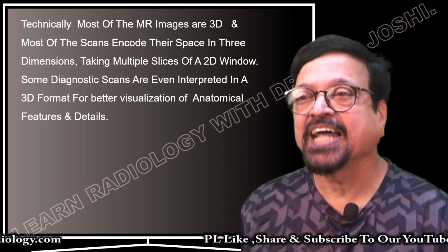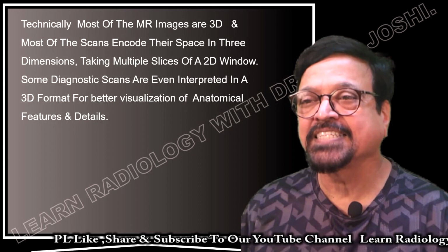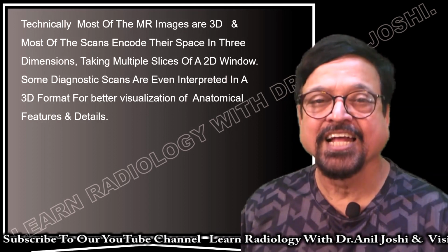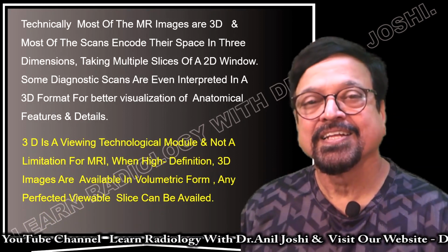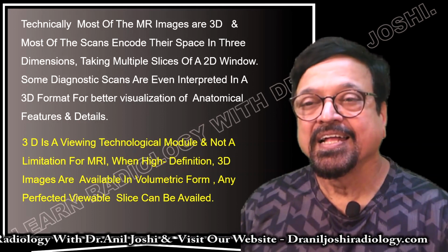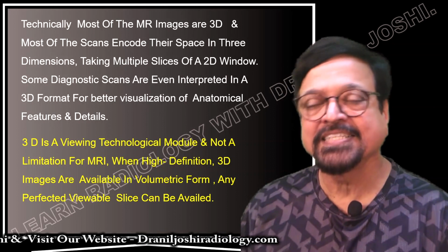Technically, most of the MRI images are 3D and most of the scans encode their space in 3 dimensions. Taking multiple slices of 2D windows, some diagnostic scans are even interpreted in a 3D format. We have seen how they are stacked and this is made better. This is a better visualization of anatomical features and details. So everything has its own advantages and benefits versus some losses or deficiencies. Now 3D is a viewing technological module and not a limitation. So for MRI, when high definition 3D images are available in volumetric form, any preferred slice can be made available.